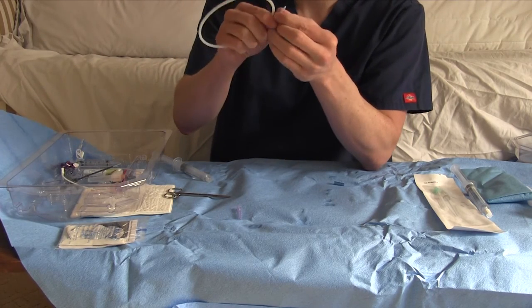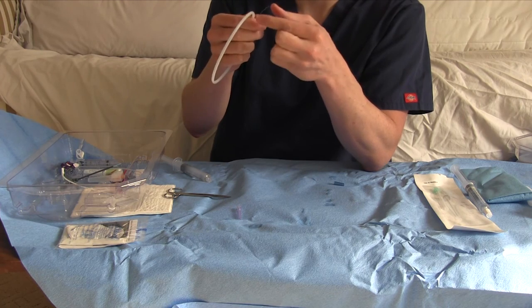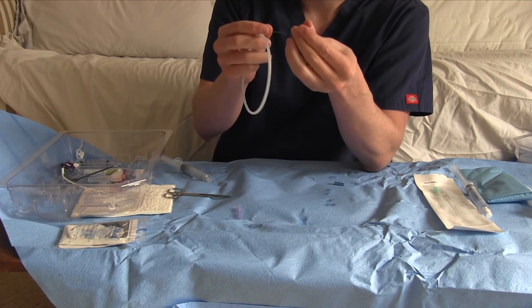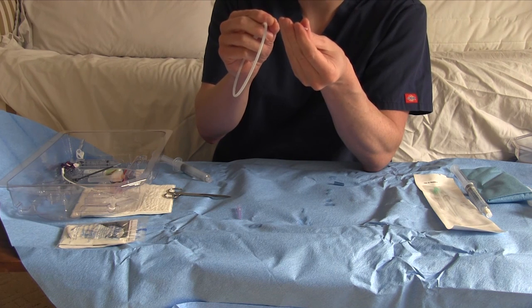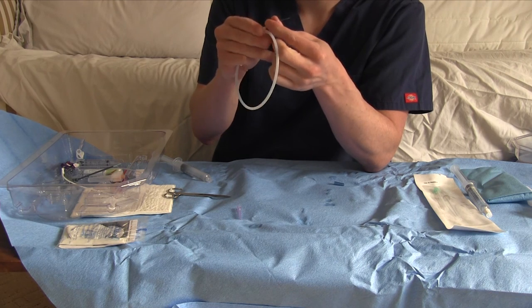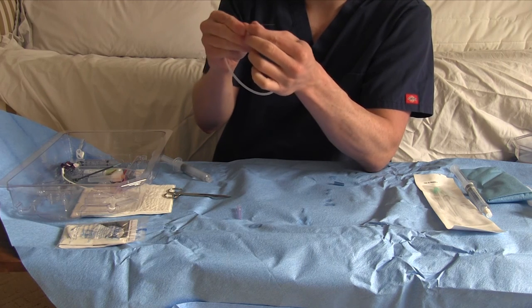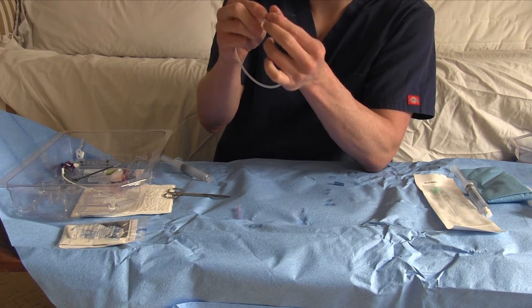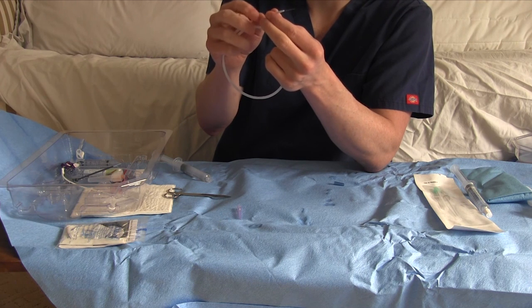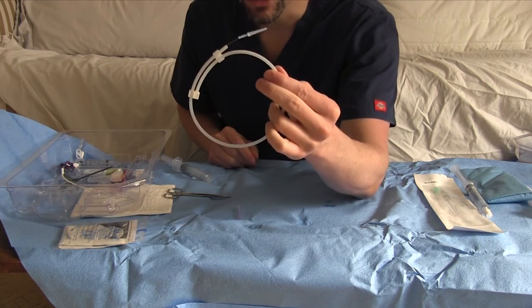This is the wire. It is a very thin wire, as is most of the stuff you're going to deal with. Super floppy so that you can't really puncture through those delicate vessels. This does make it kind of hard to align into the veins, but it does make it safer. So this little blue cheater may or may not get in your way. It does center it in the vessel, but it does make this whole thing a little bit awkward. You could figure out which way you like to use it. We'll show you that.